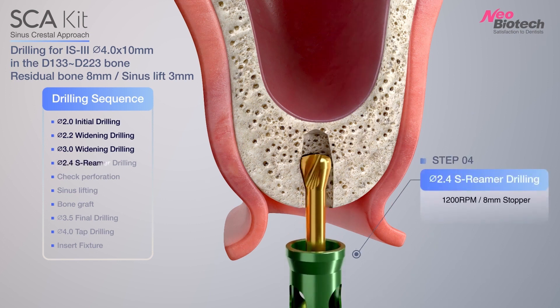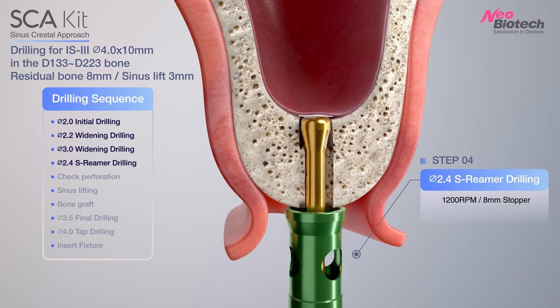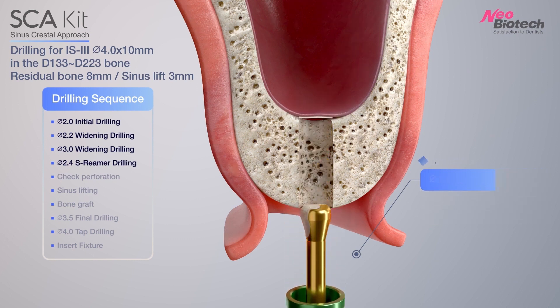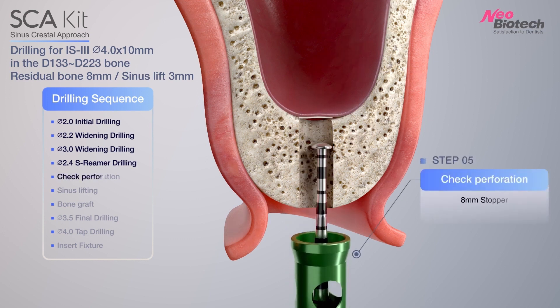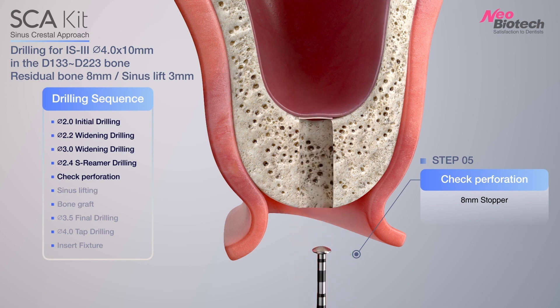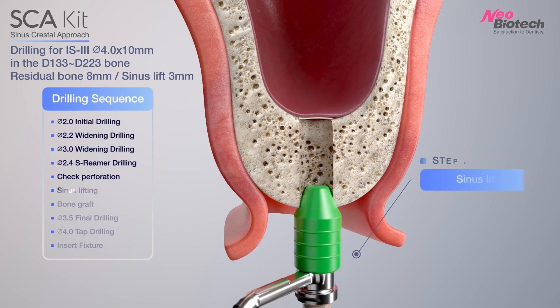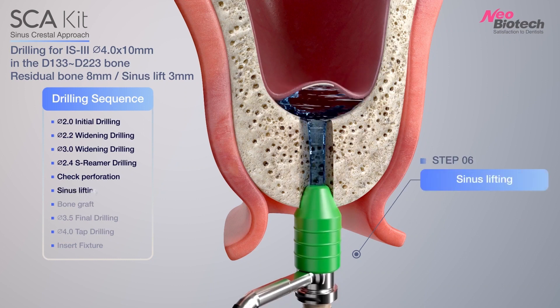Using 2.4s reamer in SCA kit, drilling the inferior cortical wall and lifting the sinus membrane about 1 mm. Check inferior cortical wall perforation with depth gauge. With AquaLift system, lift the sinus membrane with water.